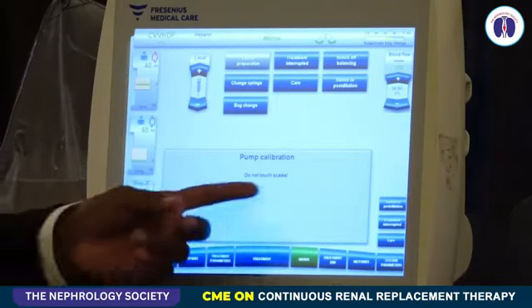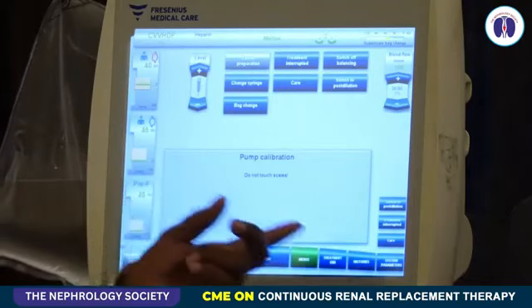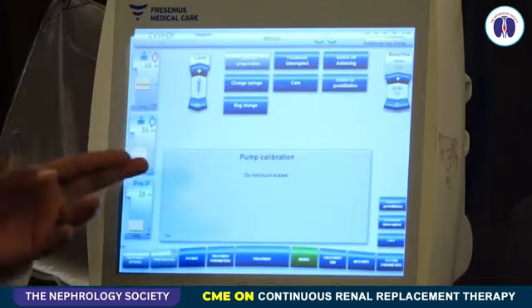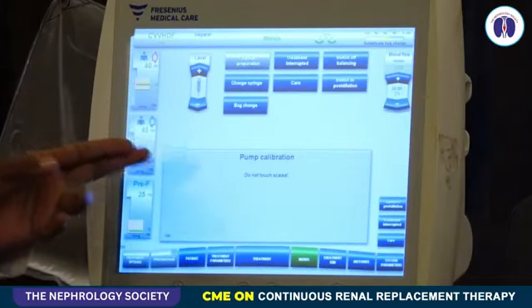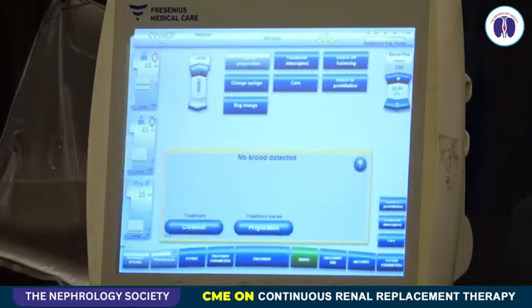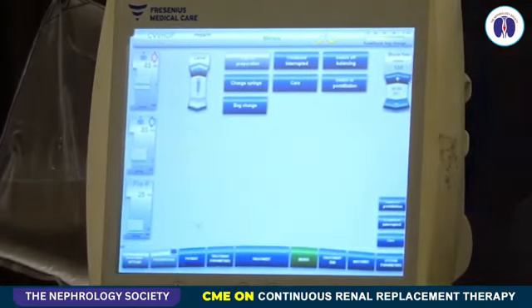That time you saw that scales 3 and 4 had an error. So if any additional force is working on the scales, bottom and up, then this error on the scale will come. Or if you are changing a bag without commanding the machine, it will come.